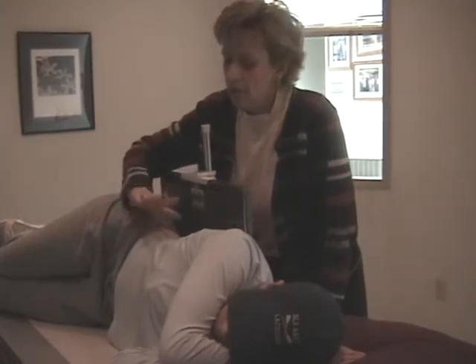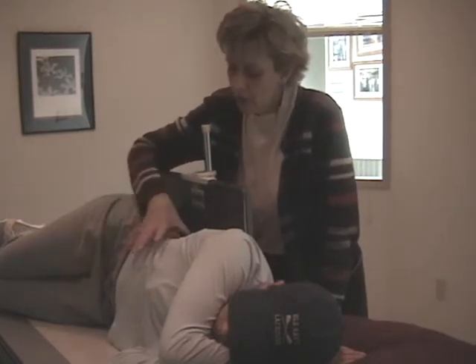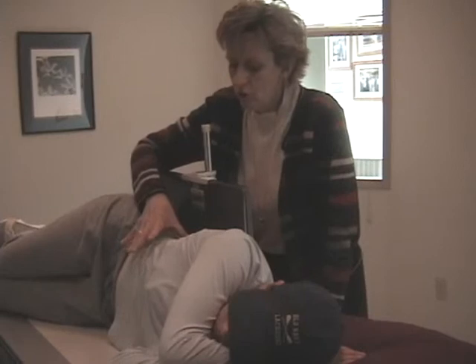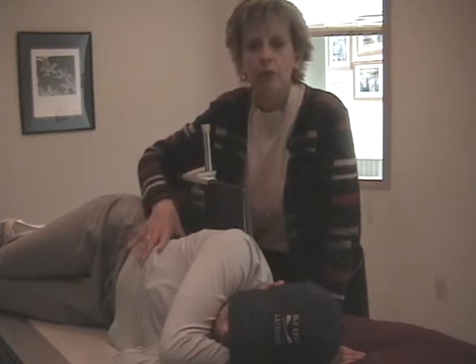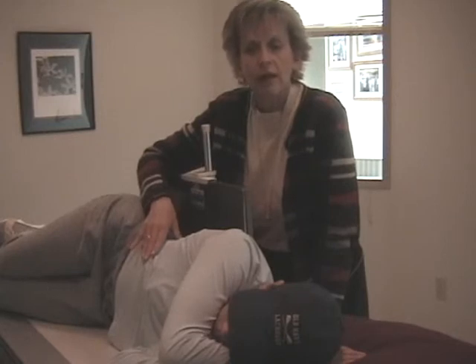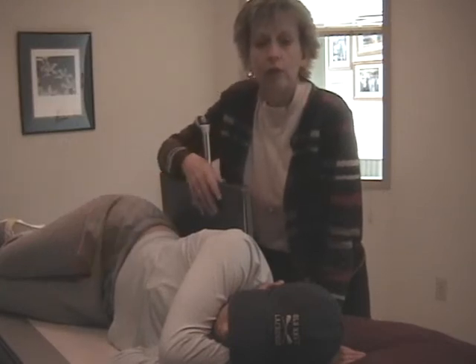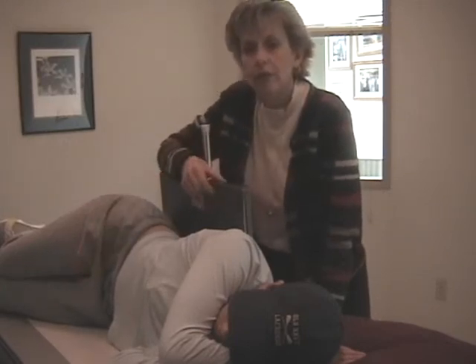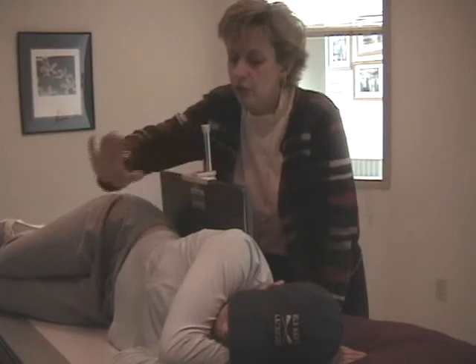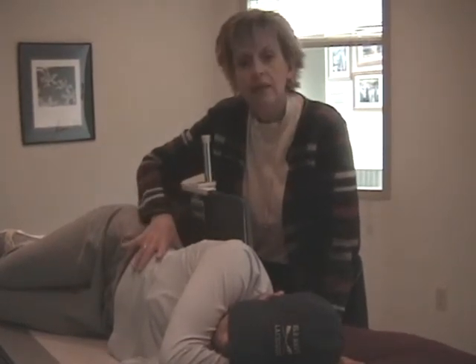But sometimes tissue really drops. Air fluid levels are going to rise. They're going to be on her right side. So from a supine KUB, if you needed 30 mAs, 40 mAs for the supine, there's a rule of thumb that you drop the amount of mAs for the left lateral by about 30%. Okay? Again, that's because the tissue drops and this part of the body becomes less dense.